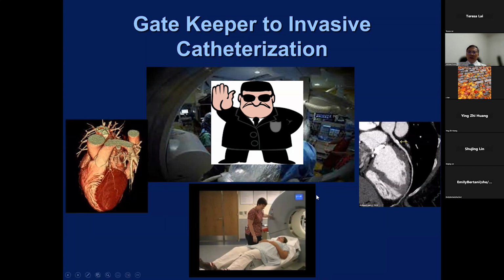You can see two very nice pictures, one colorful on the left that shows you the coronary artery in a real patient, and the other giving you a more detailed look at what kind of plaque is obstructing the coronary. In fact, this picture you cannot even see in the cath lab, because invasive catheterization, although it has a very high spatial resolution, is not very good at characterizing tissue, what is obstructing the lumen. CT is by far much, much better.